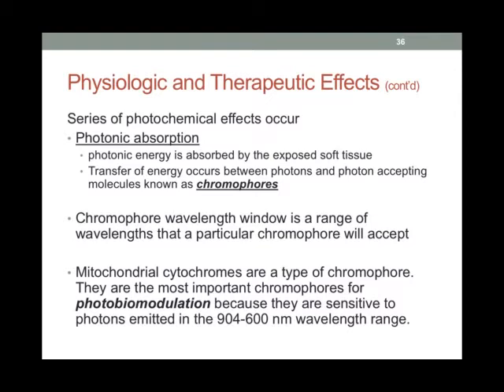So there's absorption of the photons in the exposed soft tissue, and that energy then is transferred between the photons and the photon-accepting molecules. Those photon-accepting molecules, we call them chromophores. Certain chromophores have a certain wavelength to which they're receptive.